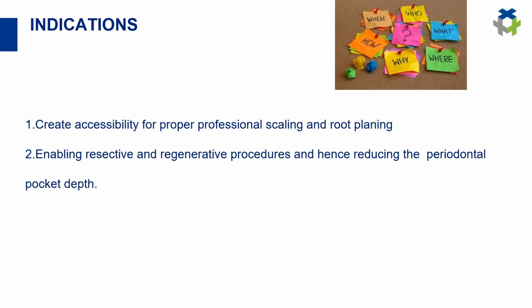Indications. We use flap surgery to gain access for thorough scaling and root planing, and to enable resective or regenerative procedures, hence reducing the periodontal pocket depth.